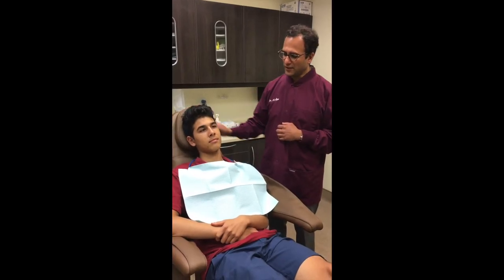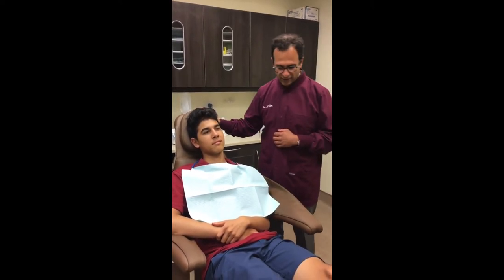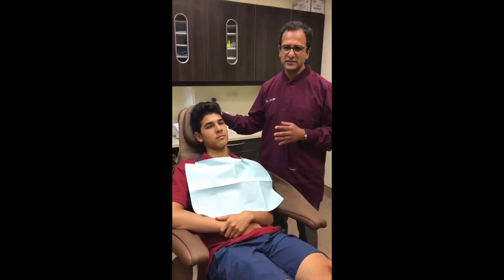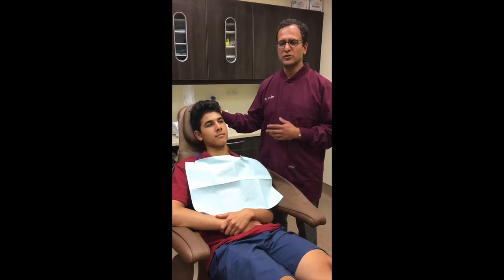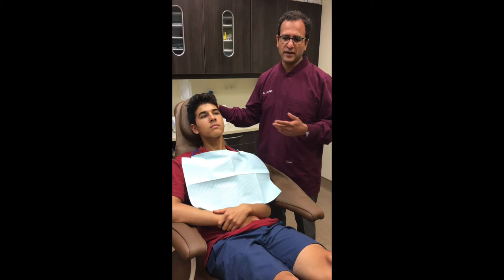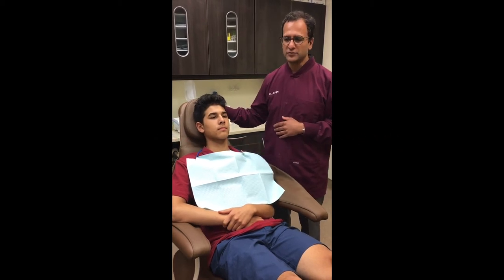So here I have my patient who we're going to use to demonstrate how to clear out a socket. Typically we don't want patients doing that before about five or six days post-operative because disturbing the socket can sometimes help to form a dry socket. So we don't want to create any dry sockets, so we want to wait about five or six days after the procedure.